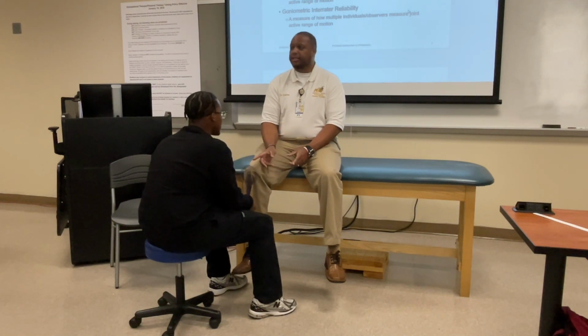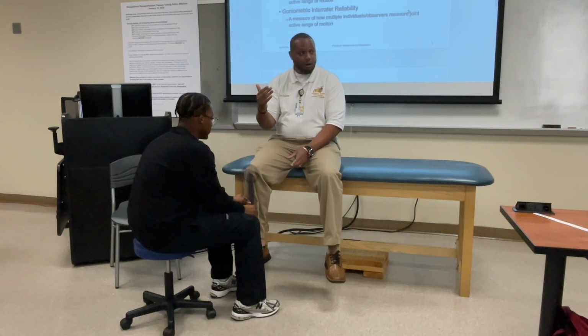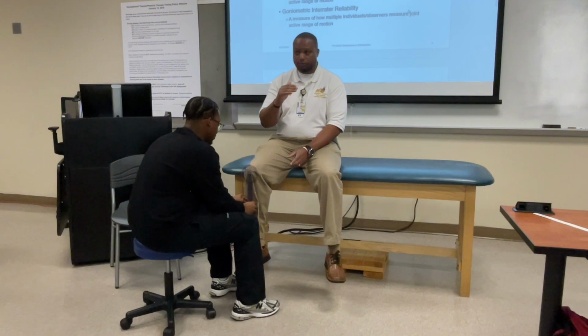And another thing, he said proximal arm and distal arm. I don't mind that, I can internalize that. But what I prefer to hear is stationary arm, movable arm. Write that down, because then, as I'm doing the practical, I think myself and Dr. McClure can process that easier. Stationary arm, movable arm. All right, I think that's how it is in Norkin and White. What did Norkin and White say? Proximal and distal. Okay, so just explain which one is which for me.